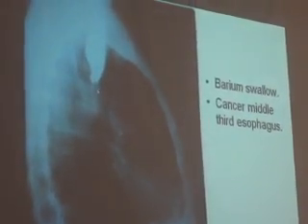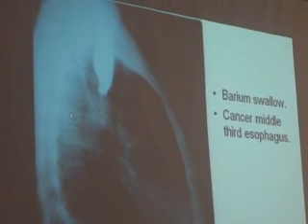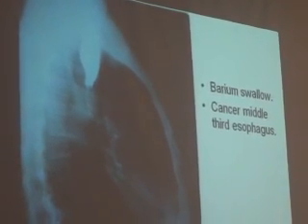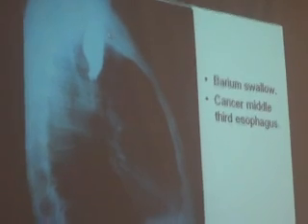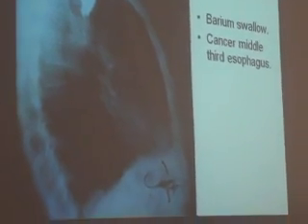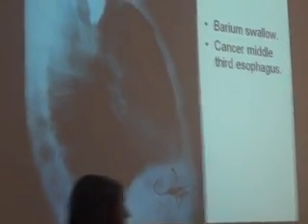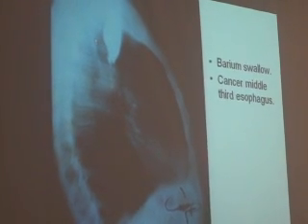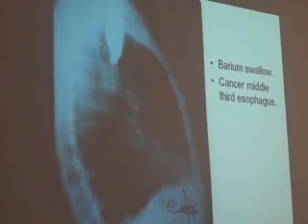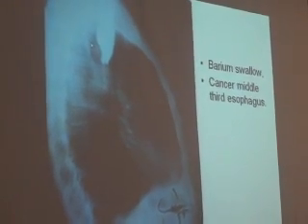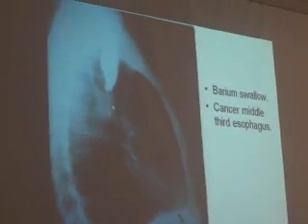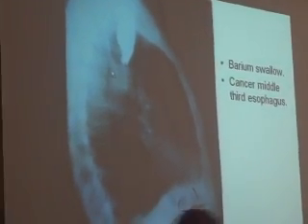Another cancer of the middle third, but with an invisible esophagus at the lower part and mild dilatation of the remaining part of the esophagus. This is not certain to be cancer without further investigation. Investigations needed: upper GI endoscopy and biopsy.